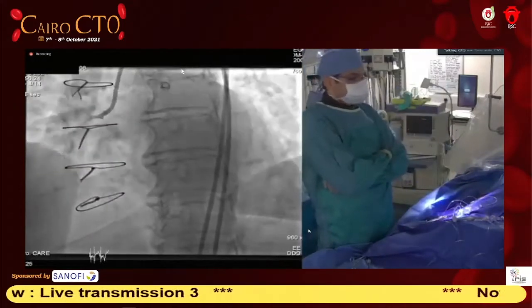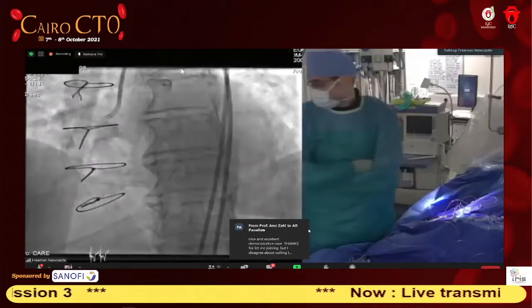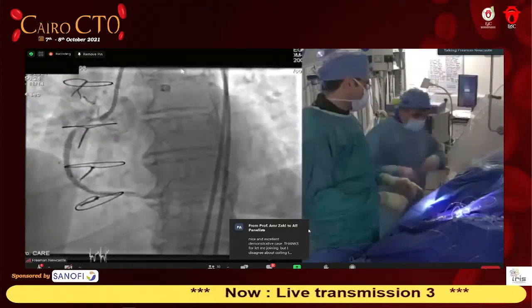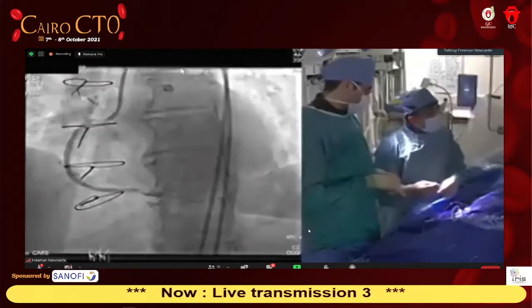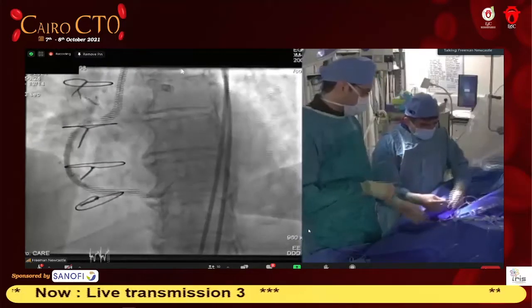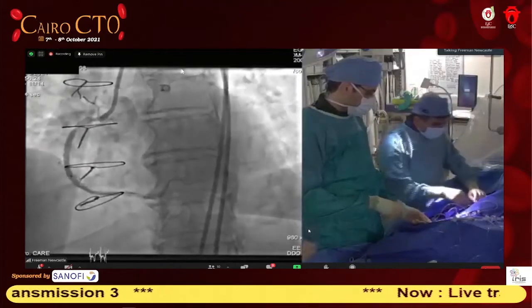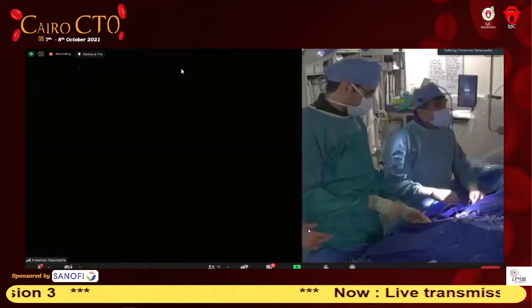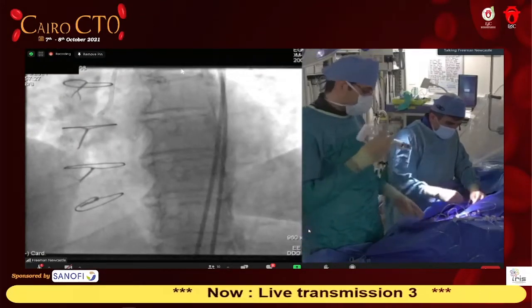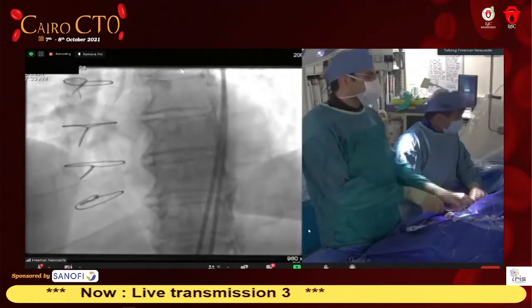So you will cover the proximal? Okay. Yeah, I'm going to skewer the artery first, and then I will assess the distal part. Because sometimes with CTOs, most of the time, you really have to have a strong discipline not to react to the angiographic appearance at the end of the procedure. The artery has been blocked for a while, it's underfilled, it's negatively remodeled, and any little disease could look really terrible. You end up putting more stent than you need. So there's no harm in waiting and making sure, at least as long as the flow is normal, at least TIMI 3 and everything is good.